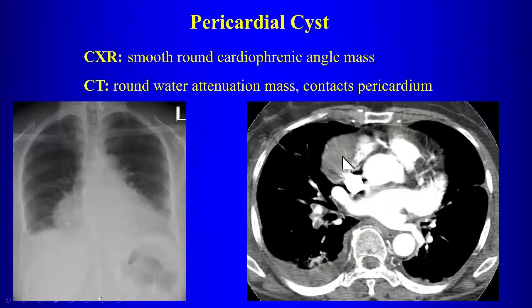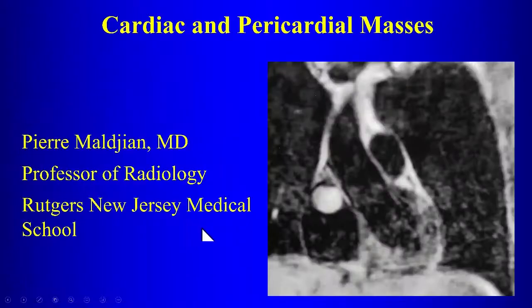Okay? Pericardial cyst: fluid attenuation in the cardiophrenic angles. And that is our discussion of cardiac tumors.